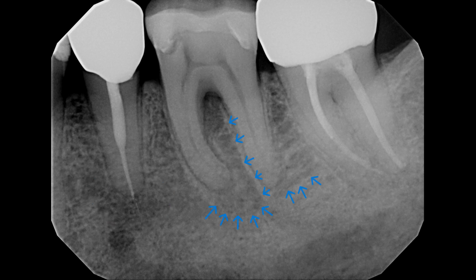We can also see dark areas surrounding the root tips of the first molar that extend from the apex of the mesial root up to the furcation of the tooth. This tooth was painful to bite test and percussion test, and pulped tested negative to EPT, so we can say with certainty that it was a necrotic tooth. We can also see that there is a deep restoration with recurrent decay that is the likely point of entry of bacteria into the pulp.